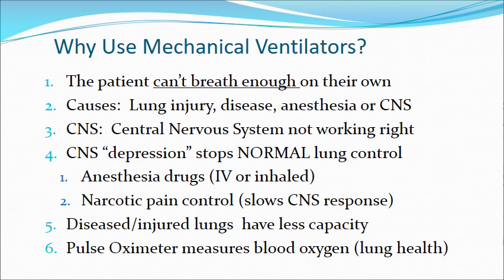Why use mechanical ventilators? And in particular, when do we go from a nasal cannula administration of supplemental oxygen to full-on ventilator support? Well, the patient cannot breathe enough on their own. And that means basically they can't perform the functions of inhalation and exhalation sufficiently to both inhale enough oxygen and exhaust enough carbon dioxide. The causes can be lung injury, disease, anesthesia, or CNS, central nervous system.